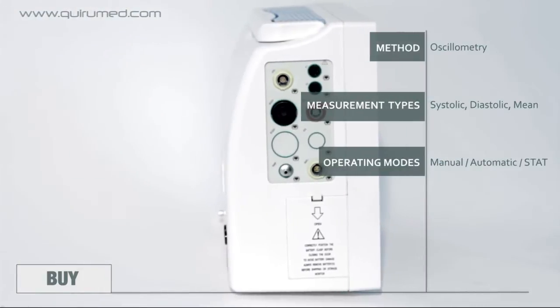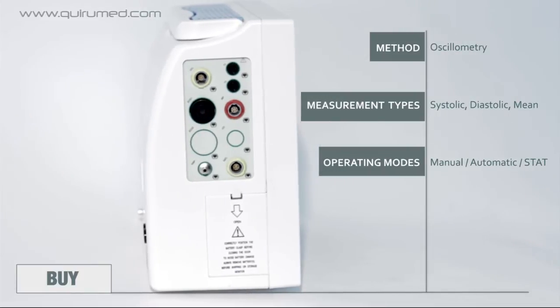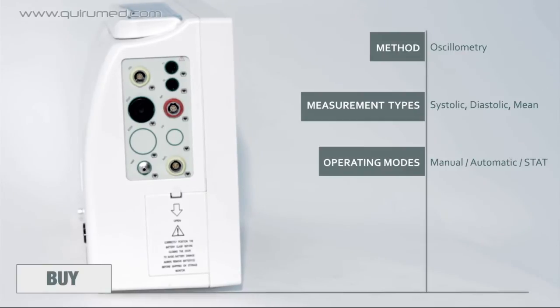This equipment measures blood pressure using oscillometry, with the possibility of systolic, diastolic, and mean readings through manual, automatic, and STAT modes.